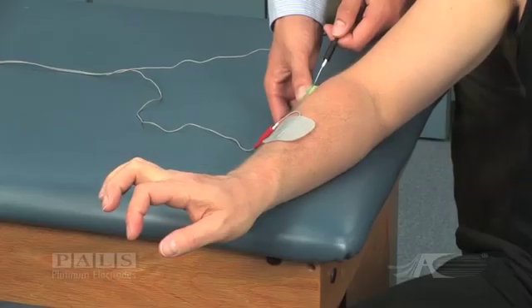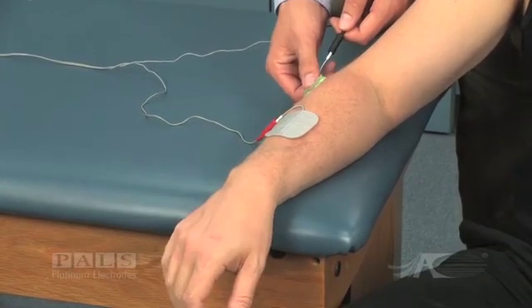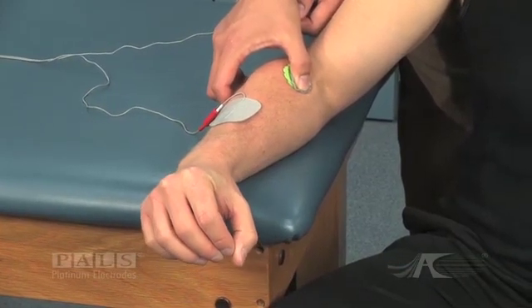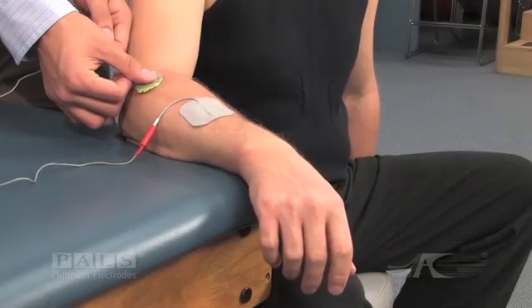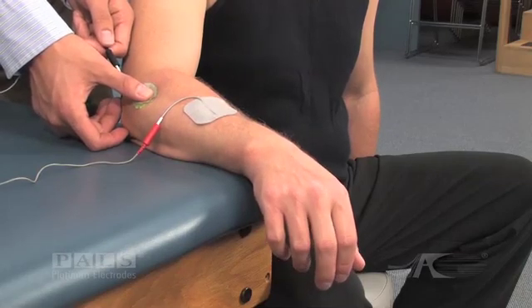In order to find the best electrode placement, the negative electrode may need to be moved. This can be facilitated by placing a wet sponge between the negative electrode and the patient. During the stimulation off cycle, the electrode can be slid over the patient's skin to allow assessment of a new location.